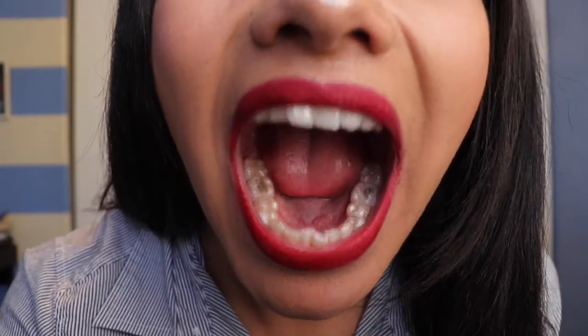So I got my Invisalign trays today, my first ones, and I have them in my mouth, so if I'm talking kind of weird, don't mind me. I'm still getting used to them being in my mouth. So my teeth, as you can see, they are very crowded, very crooked. That's why I decided to do Invisalign. I felt like braces were not for me. Ever since I knew about Invisalign, I always wanted Invisalign. I never thought about having braces.